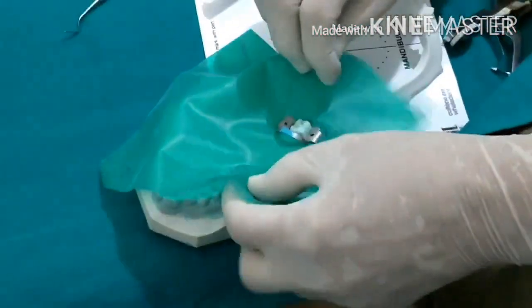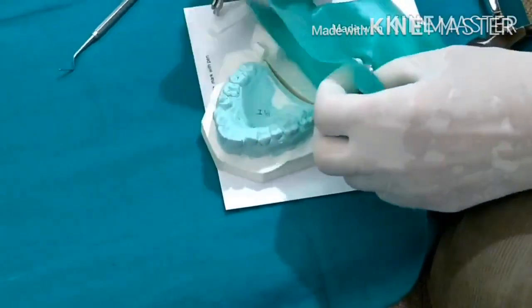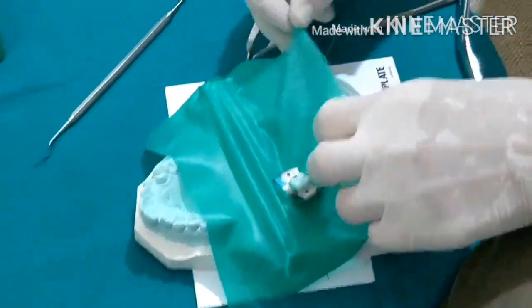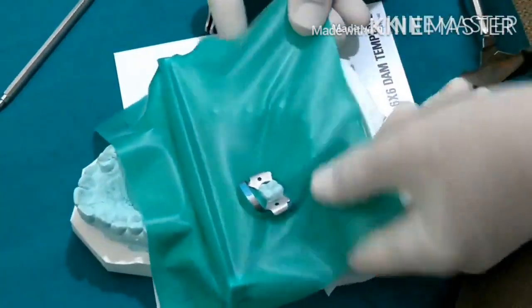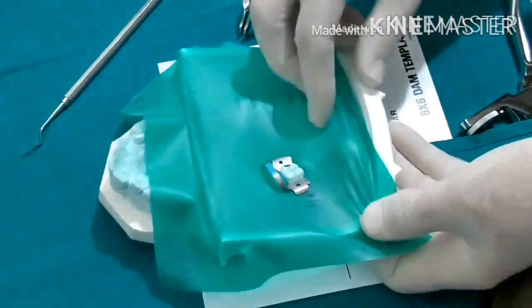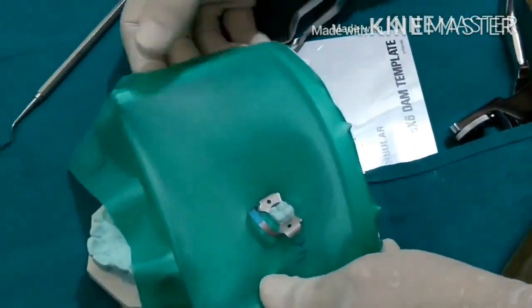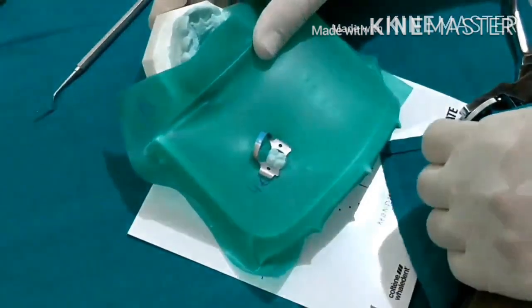Place the rubber dam frame below the rubber dam sheet and hook it, stretching it bilaterally on the upper portion, and similarly the lower portion bilaterally. Place it like this and it's all done. Fix the corners here and here, and the mandibular molar is now fully exposed.